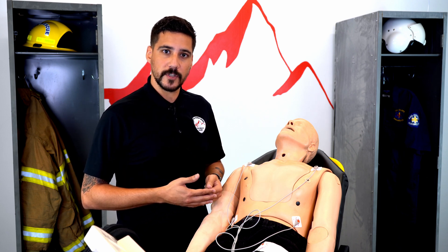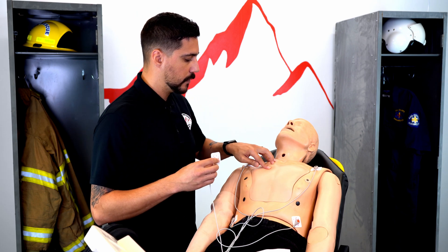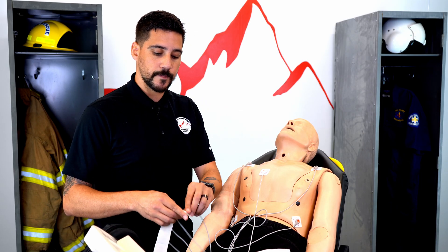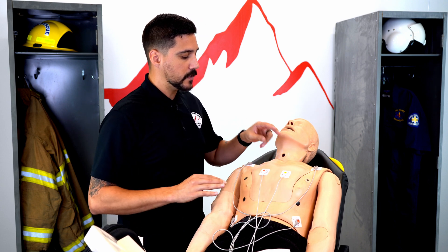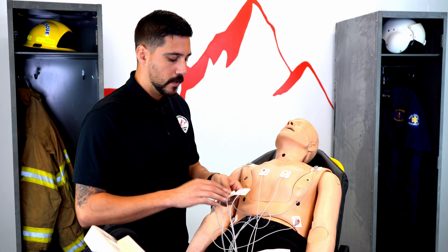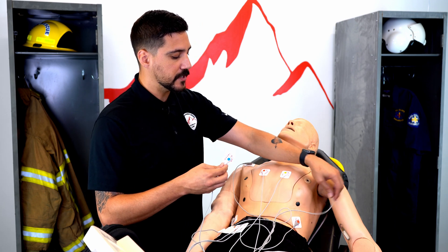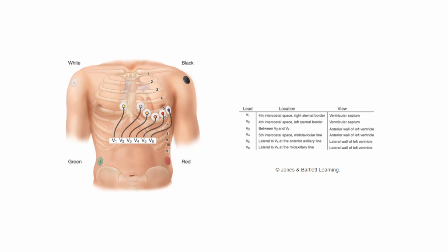Now let's say we need more information about what's going on with this patient's heart — we'll put on the 12-lead. We're going to feel down the chest until we get to the 4th intercostal space and place V1. The leads are labeled in numbered formations so it's easy to remember which one goes next. On the other side of the sternum, still in that 4th intercostal space, we place V2. Note that I'm placing everything on the patient's left and patient's right, so make sure you're distinguishing that. When putting on the 12-lead, there is a step you skip — we go from V1 and V2 directly to V4, which goes mid-clavicular into the 5th intercostal space.